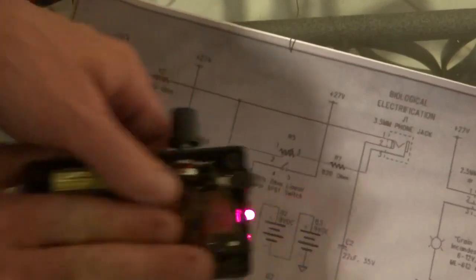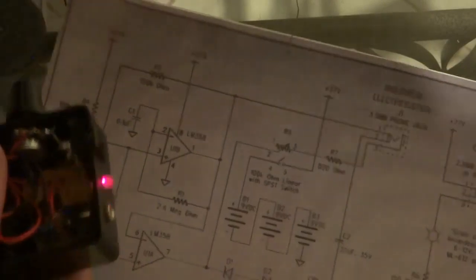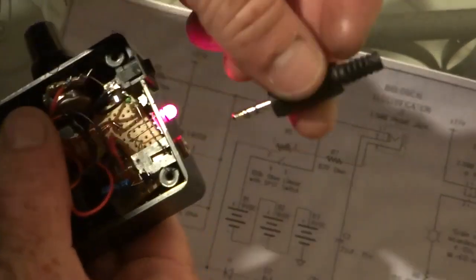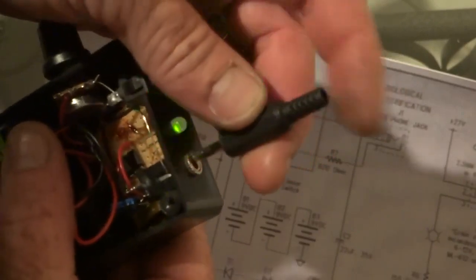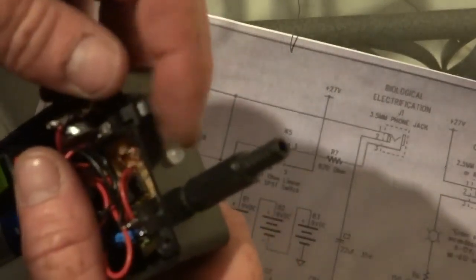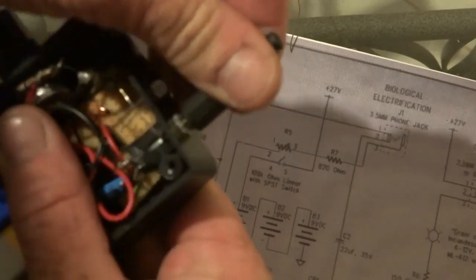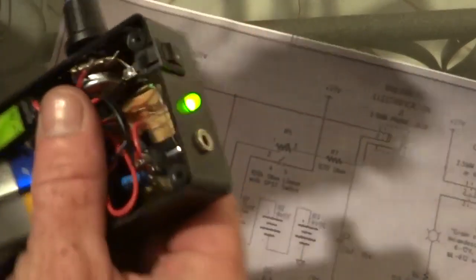Switch on, okay. You need one of these plugs — when that plugs in there, it disengages the LED like I showed you in the last video, which basically shows you that it's on.